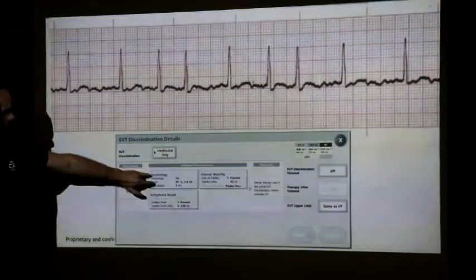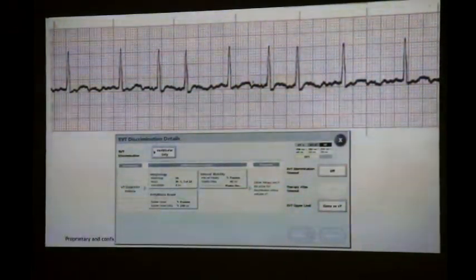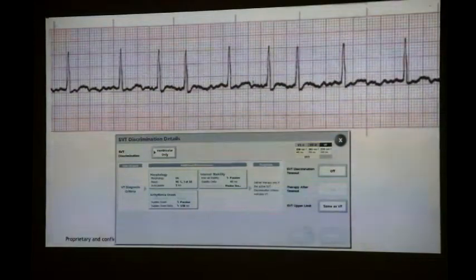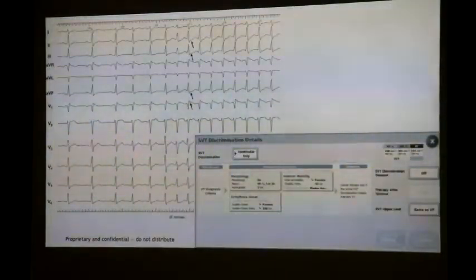This is like a broad spectrum antibiotic. These are very, very specific to certain rhythms. Interval stability only differentiates between AF and VT. Sudden onset only between sinus tachycardia and VT. You can see morphology would get that right as well. Would morphology get this right as well? It'd get AVNRT right as well.